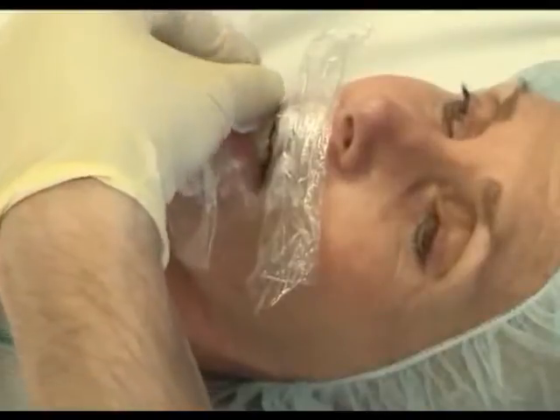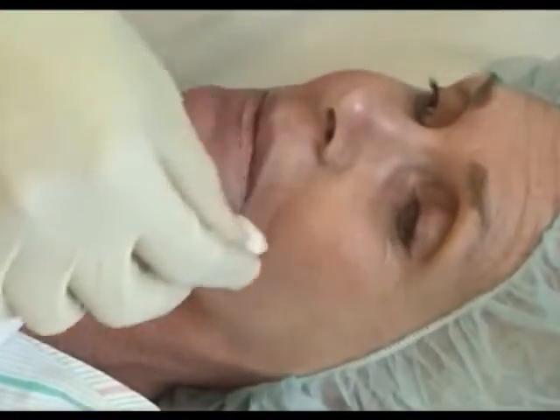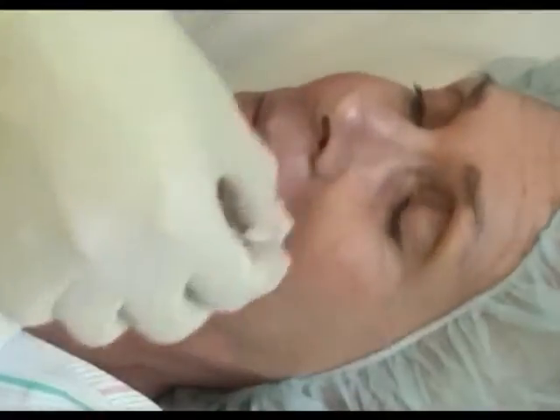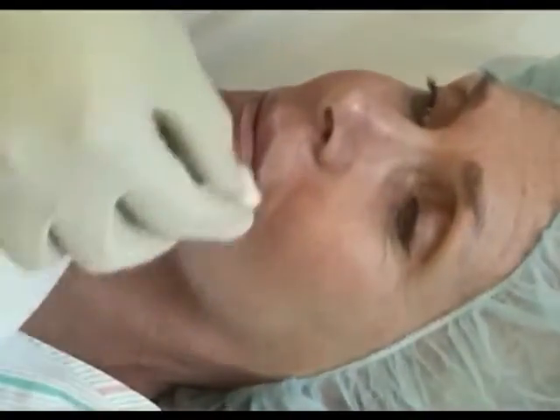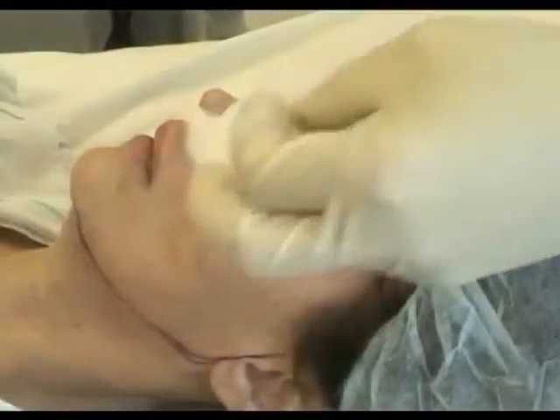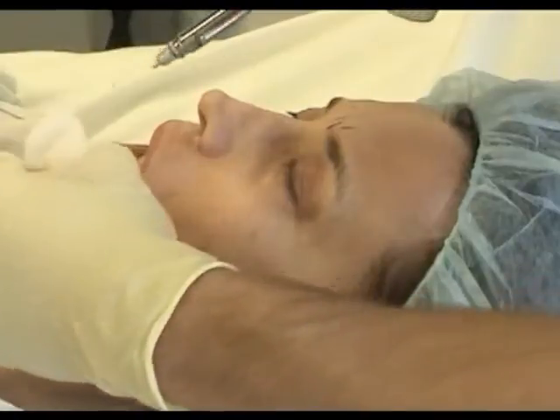Applying a topical anesthetic cream prior to the resurfacing helps not only in anesthetizing the patient, but also in fully hydrating the skin. This must be thoroughly wiped off prior to the procedure. The chin and lower lip may be anesthetized with a mental nerve block.